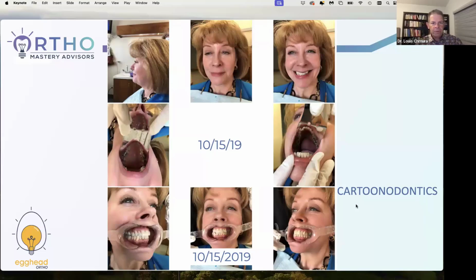So here's a situation. A patient was referred to me, just as sweet as could be. These are the pictures I got. These are the ones that were submitted to the aligner company back in the day, and came back with a treatment plan. And so I would say, what do you see? But honestly, from these pictures, I can't see a whole lot. I mean, the pictures are horrible. And you'll see this one as an example of what not to do on Tuesday.